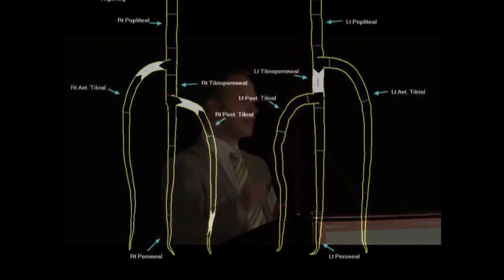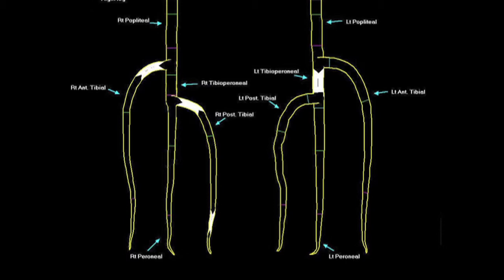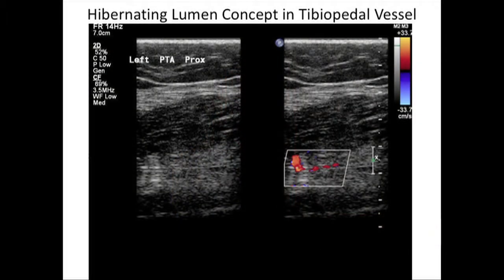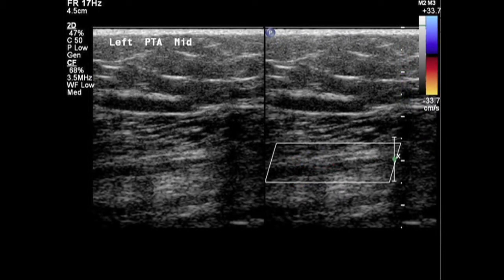I also like to comment on what I call the hibernating lumen phenomenon. On angiography using both antegrade and retrograde approaches, we see large segments of hibernating lumen, and I believe ultrasound supports that concept. This is a graphic reconstruction using the WIP product by Philips — showing occlusions at branch points with reconstitutions in distal portions due to collateralization. One patient had a completely occluded posterior tibial artery proximally, but a large open, non-calcified lumen in the mid portion with no flow, and from a retrograde approach had very easy reconstitution of flow.